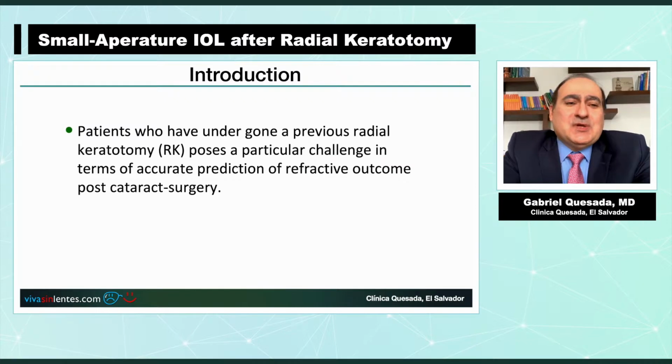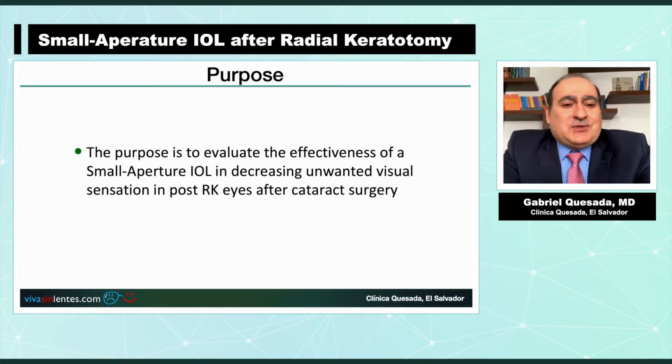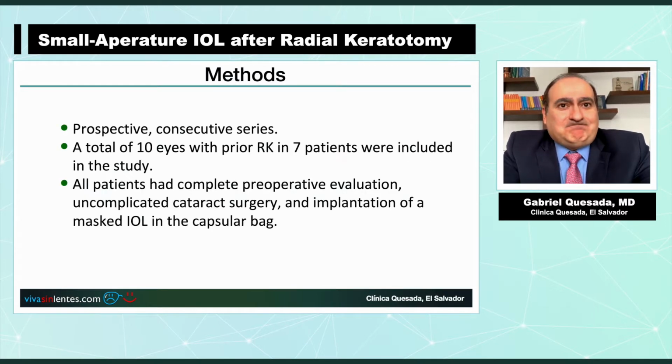As an introduction, we know that patients who have undergone a previous radial keratotomy pose a particular challenge in terms of accurate prediction of refractive outcomes post-cataract surgery. So the purpose of this presentation is to evaluate the effectiveness of a small aperture IOL in decreasing unwanted visual sensations in post-RK eyes after cataract surgery.